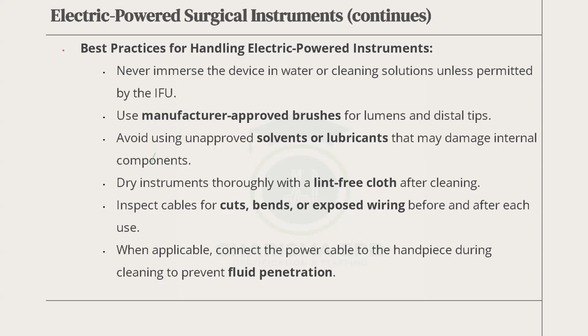Avoid using inappropriate solvents or lubricants that may damage internal components. Like I told you, in my department, I mentioned so far 5 powered surgical implements. Each of them has its own lubricant. You cannot use Osada's for Trudy. Same way you cannot use Trudy's for Comet. You cannot use Comet's lubricant for what? Striker. That's how it is. Okay, so stay put. Be very, very attentive to whatever you're doing, and then you get it right.